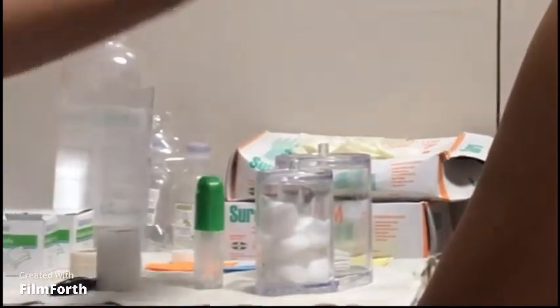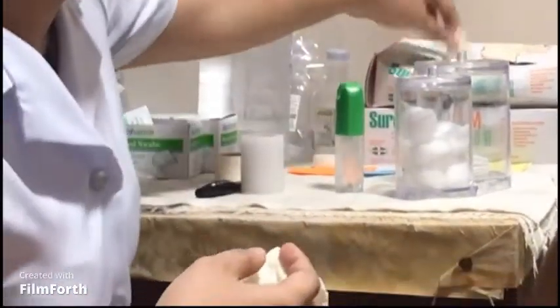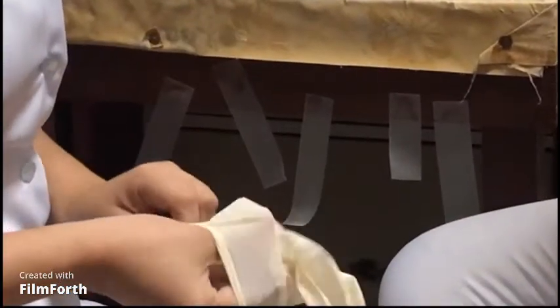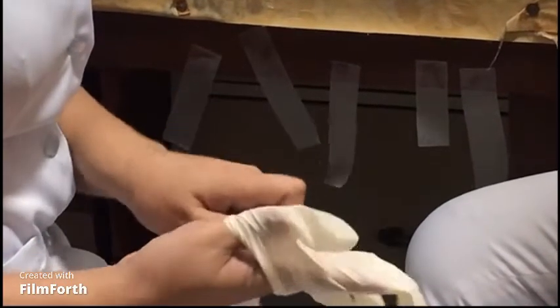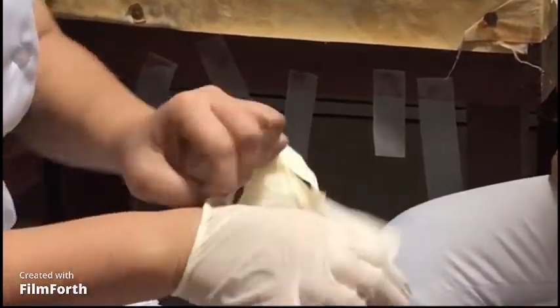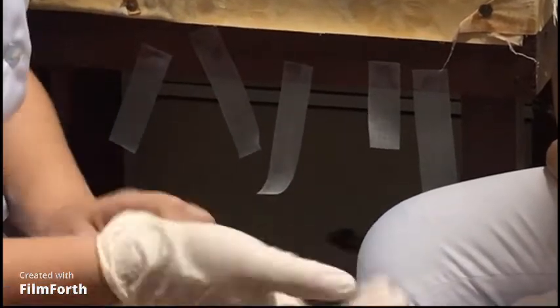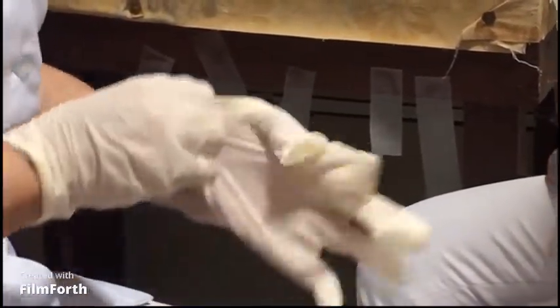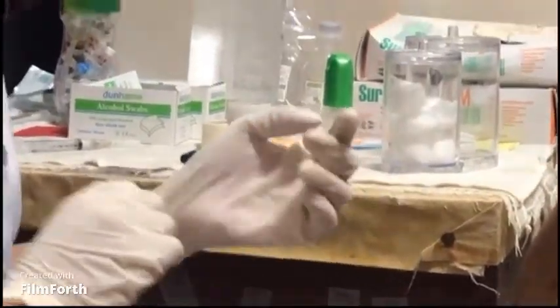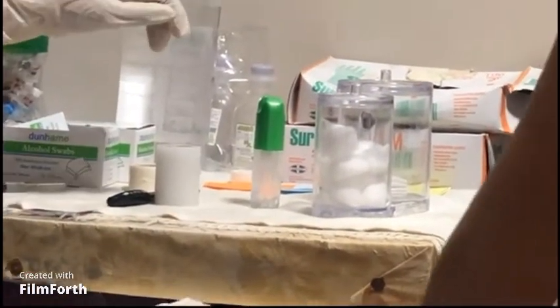Put on clean gloves. Clean the site with an antiseptic swab using a circular motion.